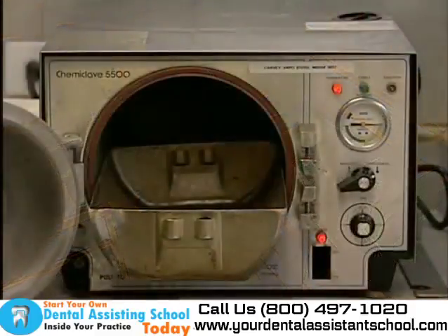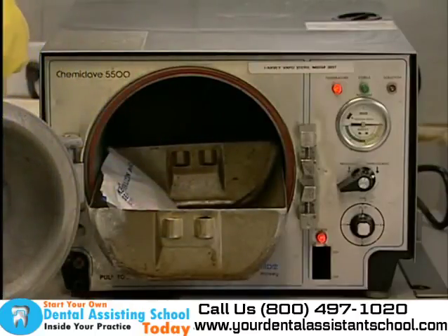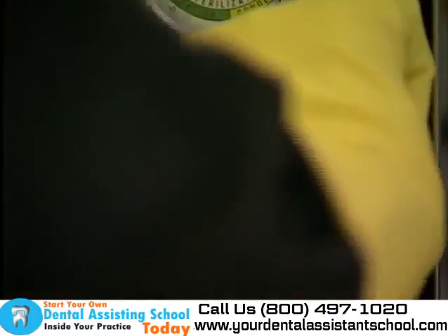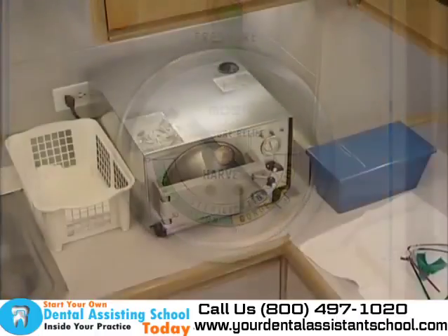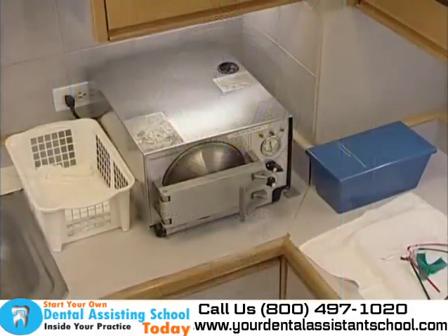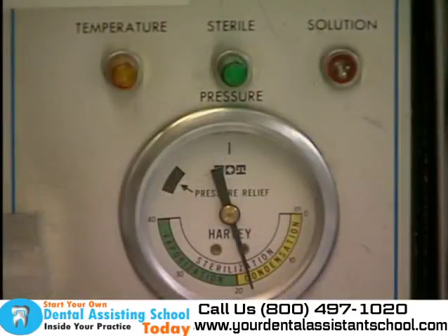The autoclave should not be overloaded in order to allow the steam to sufficiently kill all microbial forms. The temperature and pressure of the autoclave must reach the manufacturer's recommendation before the sterilization cycle can begin. Because of the pressure, an autoclave should never be opened until a safe internal temperature has been reached. If opened before the cycle has ended or before the unit has cooled, severe steam burns could occur. Check manufacturer's guidelines for a safe cooling temperature.